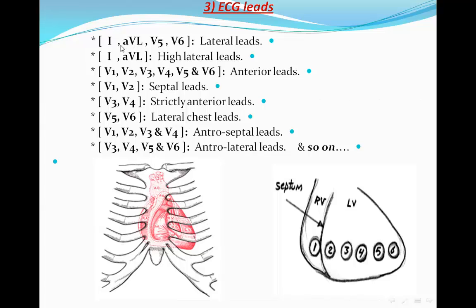The grouping: I, AVL, V5, and V6 are the lateral leads. If changes are confined only to I and AVL, these are the high lateral leads — high lateral ischemia or infarction. V1 to V6 collectively are the anterior leads. V1 and V2 record the septum, V3 and V4 are strictly anterior, and V5 and V6 are lateral — because the chest is rounded and the electrodes wrap around it, recording mostly the left ventricle rather than only the anterior surface.